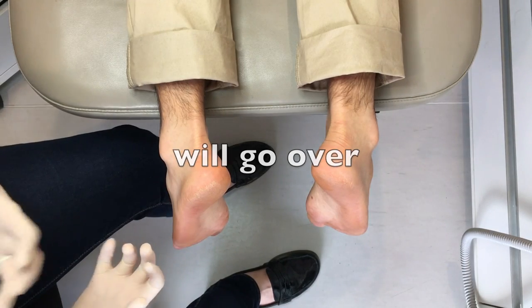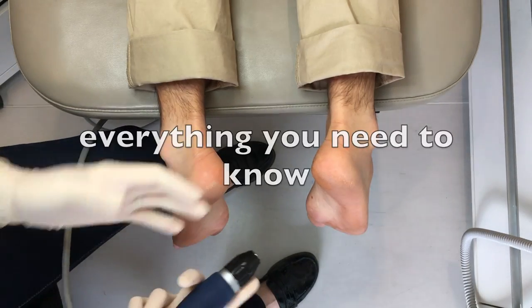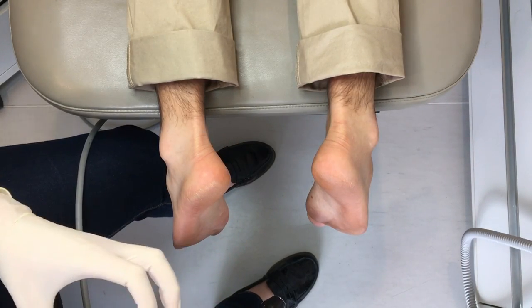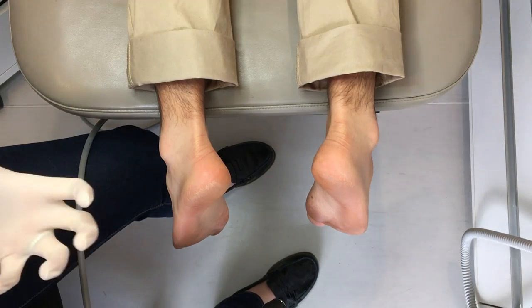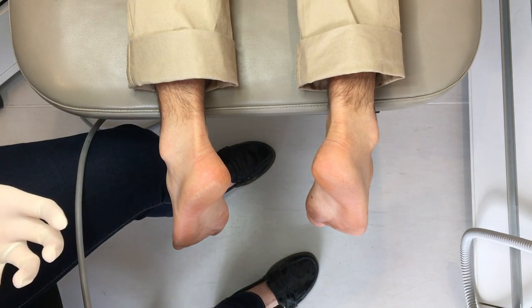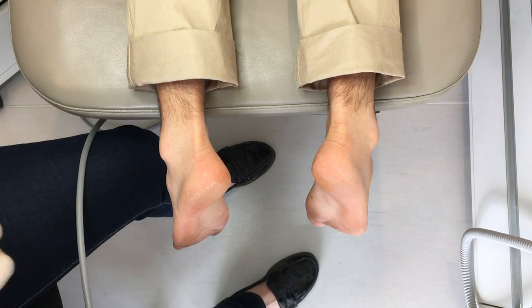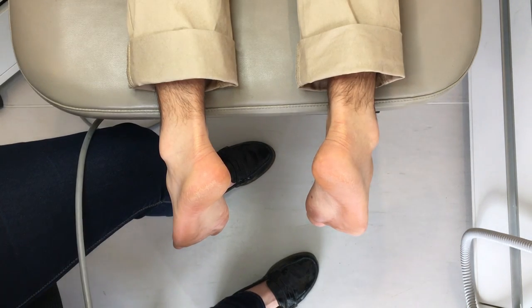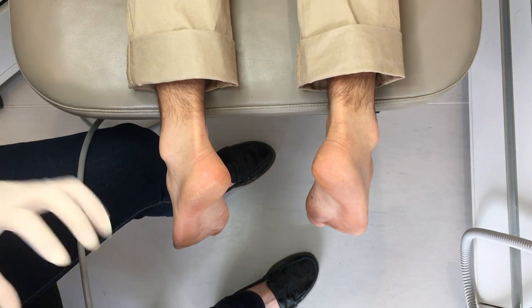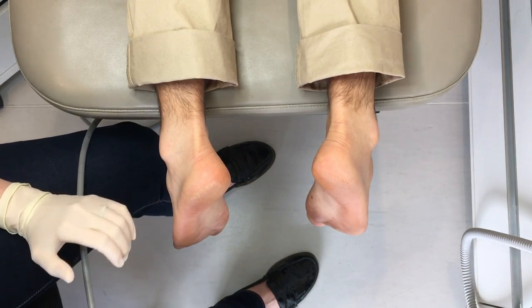Essentially what it is, is we use a probe to deliver high-energy sound waves to the area where there's pain. What that's thought to do is increase blood flow to the area, metabolic activity in the area, and start a healing process. A lot of times with issues like tendinopathies and plantar fasciitis, that healing process is really slow or doesn't happen at all. So in combination with a lot of other treatments, shockwave therapy is an option to get that healing process started.